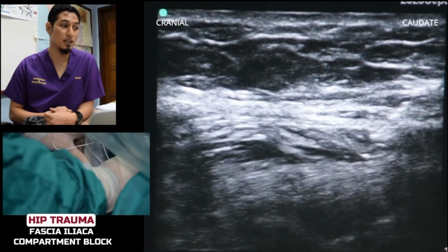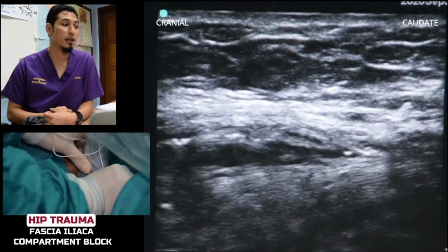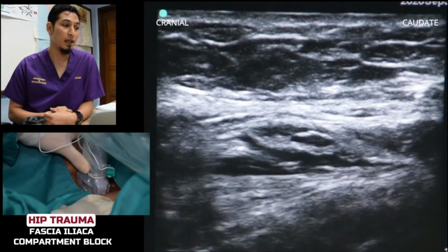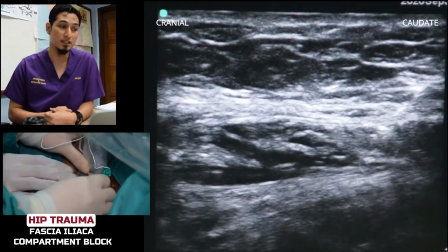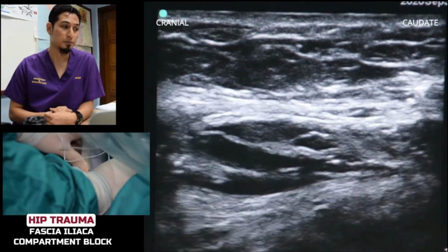As you can see, the LA spreads very nicely towards cranially, and if it spreads more cranially, then there is possibility it will spread to the lumbar plexus.